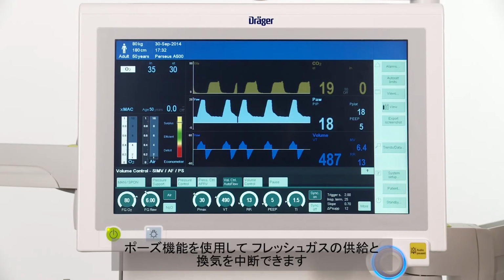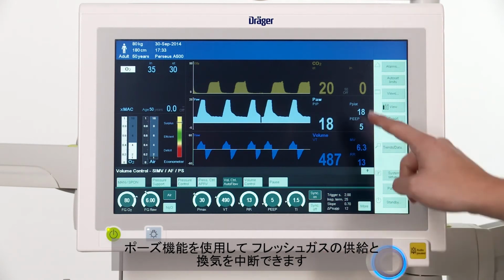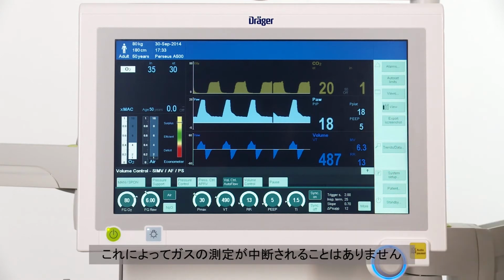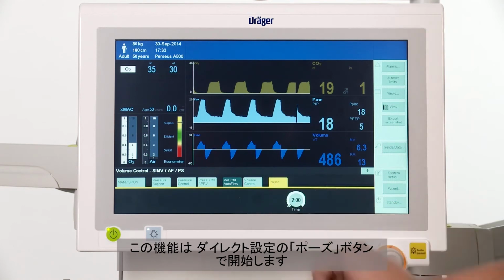You can use the pause function in order to interrupt fresh gas delivery and ventilation. This will not interrupt the gas measurement. This function is started via the pause button in the therapy bar.